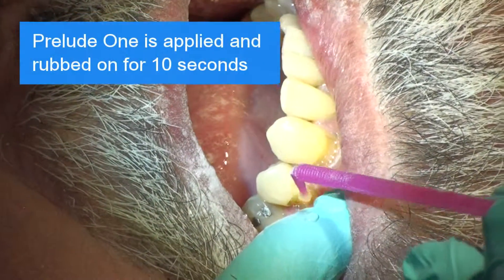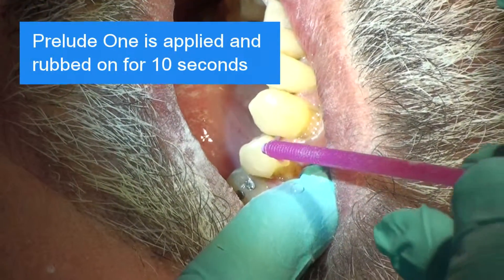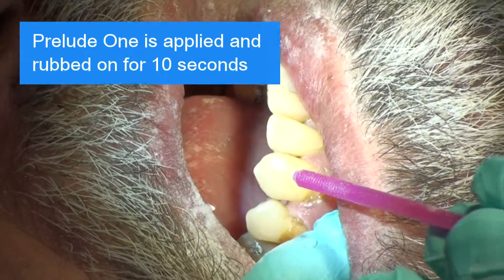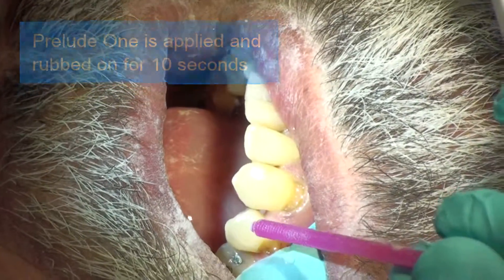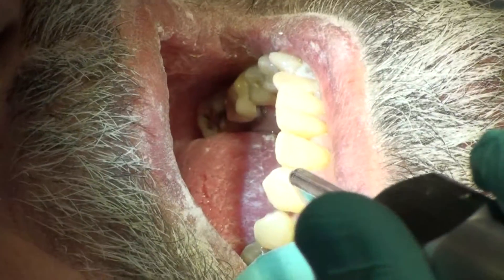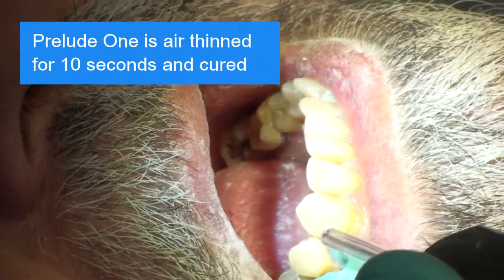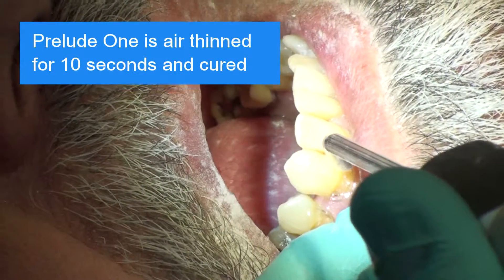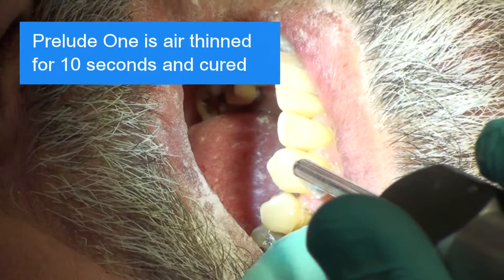Prelude 1 Universal Adhesive is applied and rubbed in thoroughly for at least 10 seconds. Prelude 1 is air thinned and its ethanol carrier is evaporated with 10 seconds of air and cured.